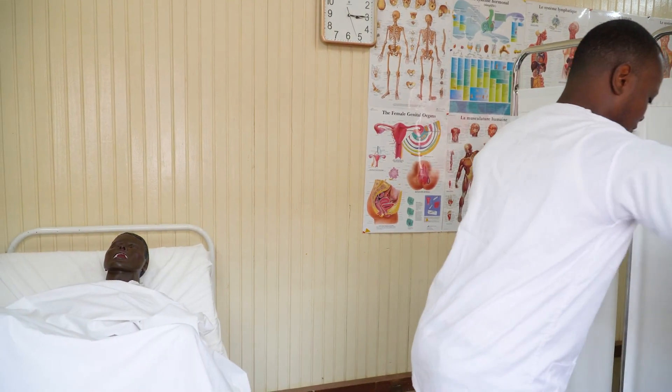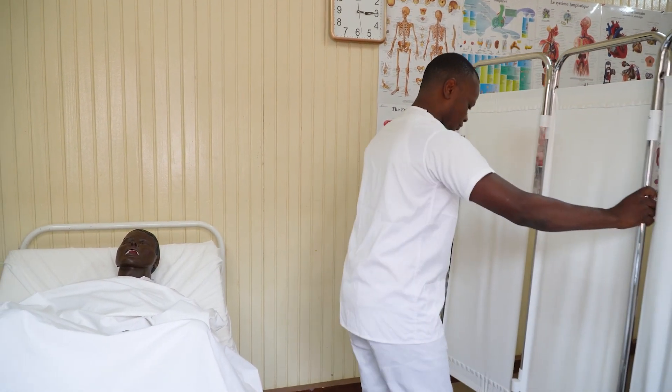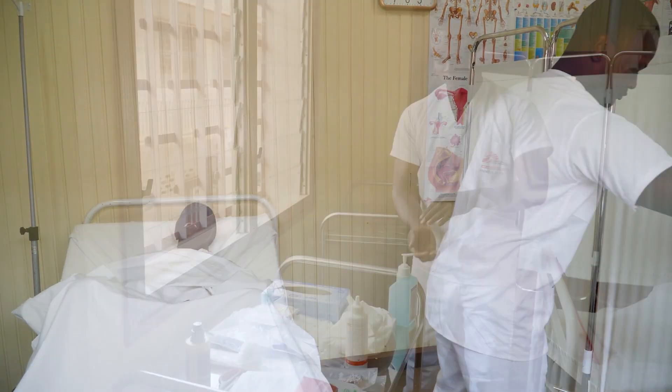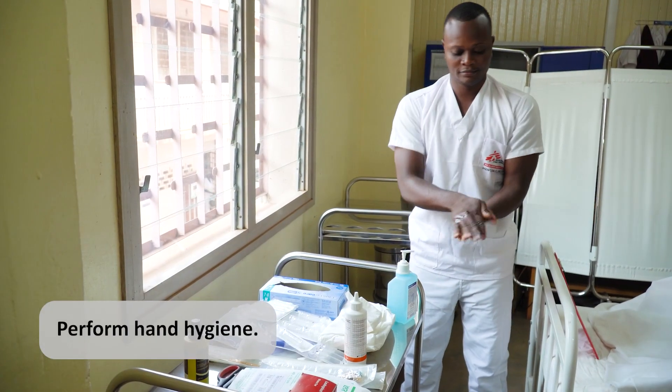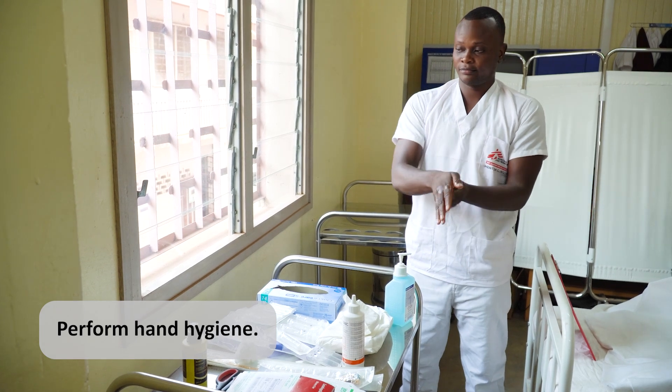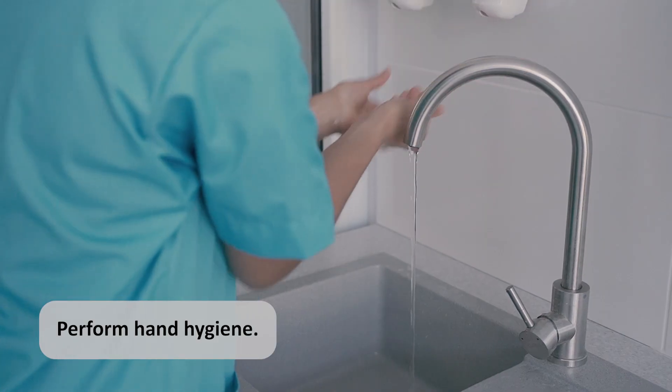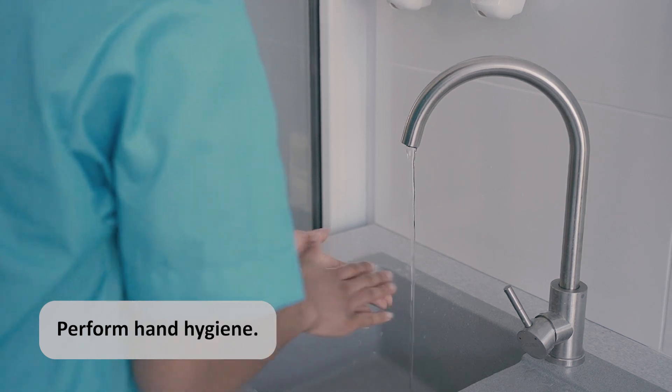Let's talk about how to prepare for a urinary catheter insertion, as there are a few key steps before we begin gathering our equipment. Before we go in to meet our patient, we must perform hand hygiene, preferably using alcohol-based hand rub, or if our hands are visibly soiled, using soap and water.